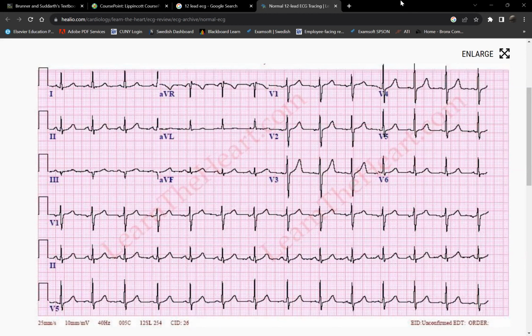Now, as far as the changes go, let's say this patient has any abnormalities in the ST and T changes, depending on which lead it appears in, it gives the doctor an idea about where the heart attack or the ischemia is coming from. Is it posterior? Is it on the base? Is it on top? Is it on the right side? Is it on the left side? Does that make sense? Okay, so let's not concern ourselves with that though, because that is the doctor's job. We will not be doing that diagnosis. Are we clear?